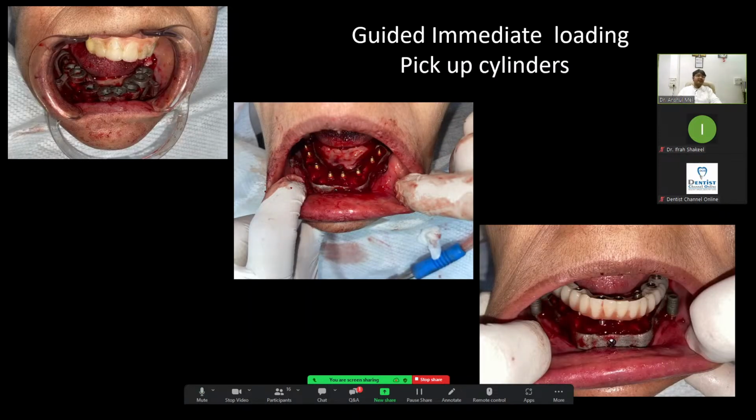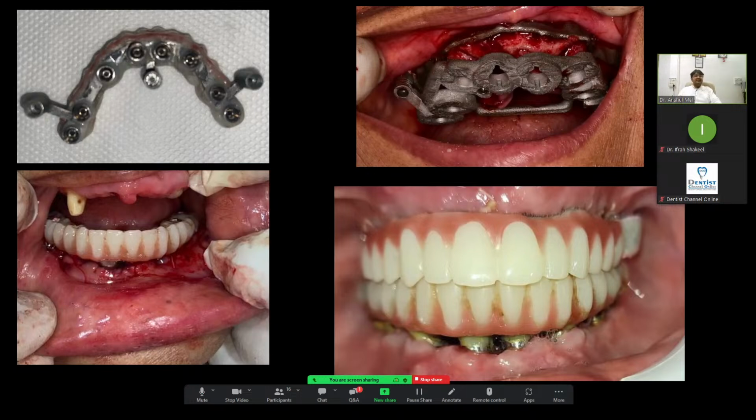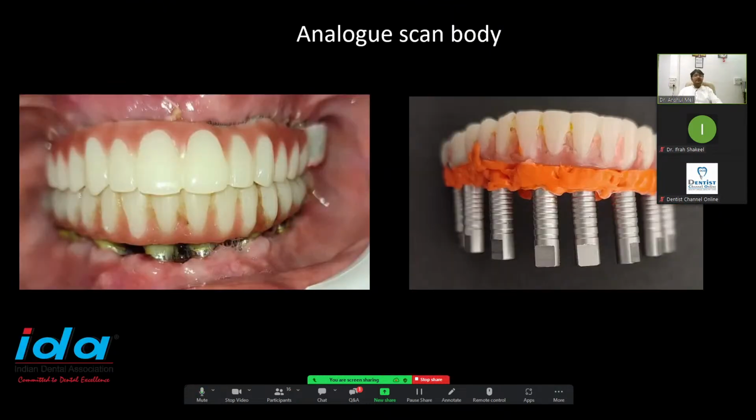The same way, if you have done bone flattening, like the cases in which we have done flattening, after 3 months there is a chance of recession like this. But you want to use the same technology for the final. So we just flow light body below the prosthetic in this area, take it out completely, place a lab analog and pour the cast. So that's how you can finish off your first part, in which your impression is done, your occlusion also, and your prosthetic you can mount and finish off with the manual technique.